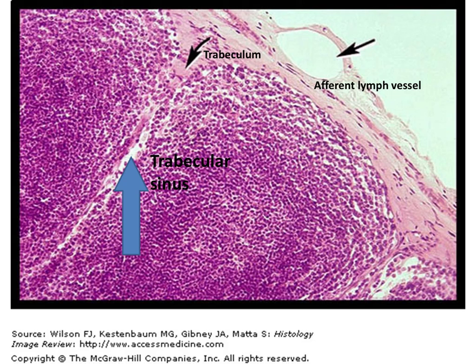Very nice picture again for the lymph node. Here we have the capsule, and the capsule is covering the cortex, of course. Here, this is the cortex formed of the lymphatic follicles. Here we have the trabeculum, which is red, and the white area is the trabecular sinus. Here we have a large vessel. This vessel is the afferent lymph vessel, which enters the convex border. You may be asked about what this border is. It is the convex border of the lymph node.